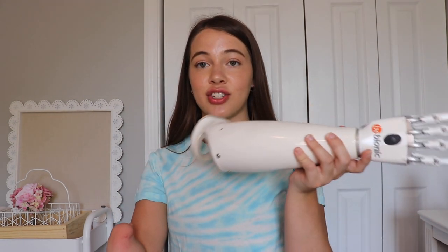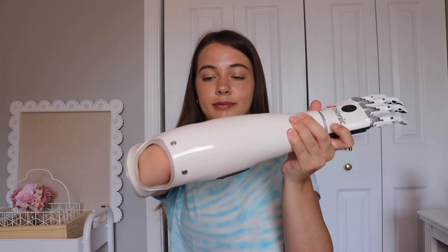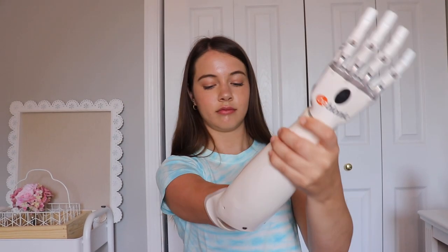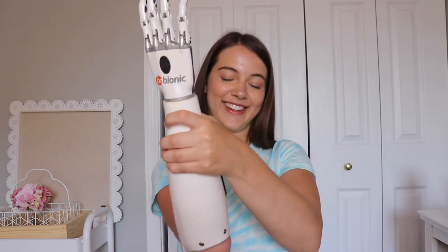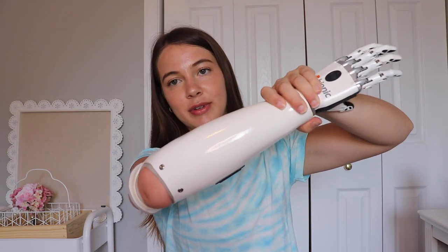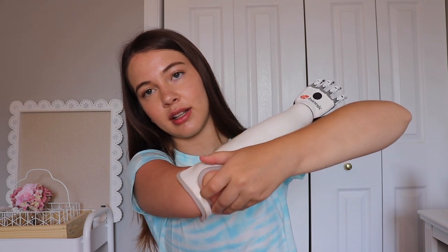Okay, so now I'm going to show you guys how I actually put the arm on and show you all the different grips it does. So when I'm putting on my prosthetic arm, I like to put hand sanitizer on it just to make it go a little more smoothly. Without the hand sanitizer, it would be kind of hard to get the prosthetic arm on. So I just put a nice amount on, rub it on, and then I can slip it on. I want to make sure that it's on all the way so I make sure my arm is fully in there.